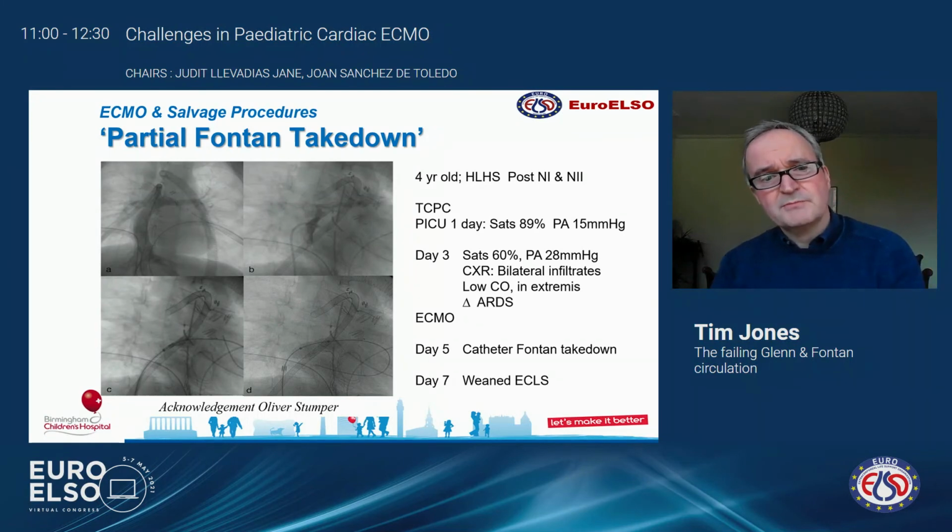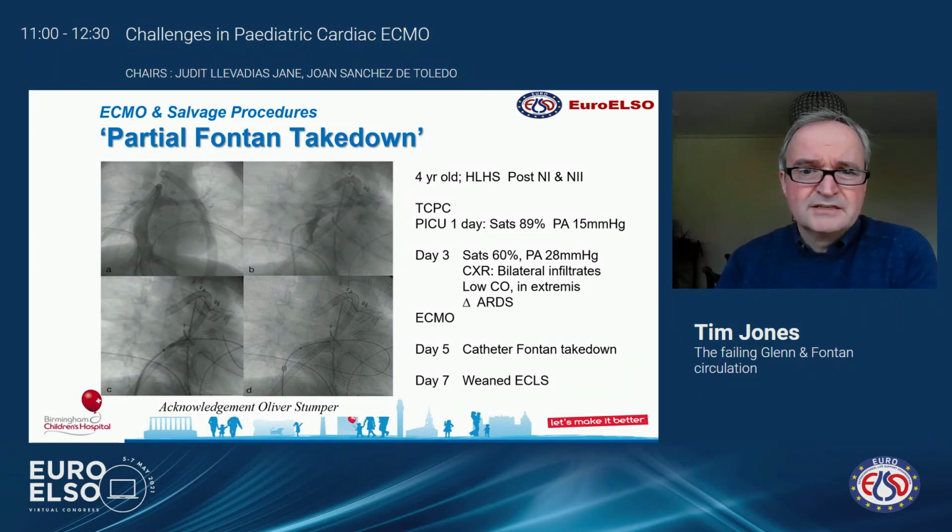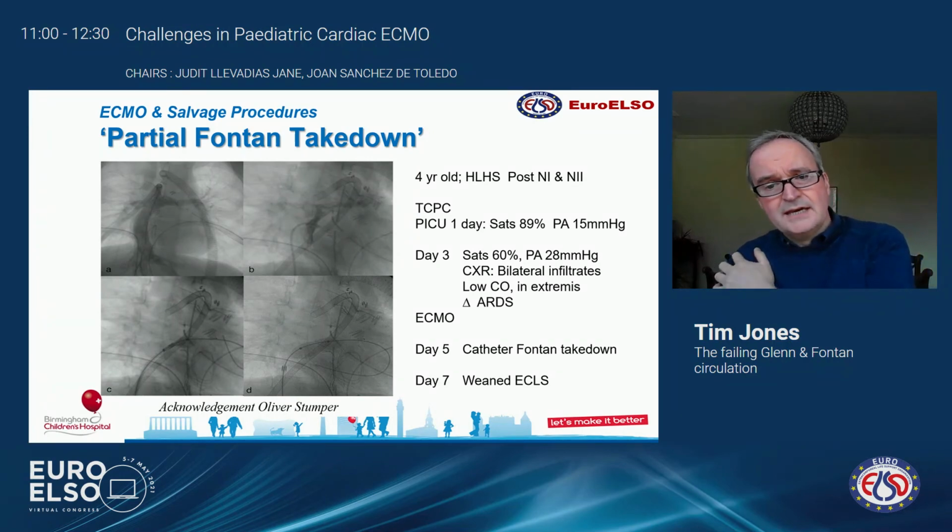So finally, just to mention, this is a case, we've done this a number of times now, for takedown of the Fontan, a 4-year-old who developed ARDS, and then we ended up putting them on ECMO. They're really in extremis. The only way we thought we could get them off was to take down.